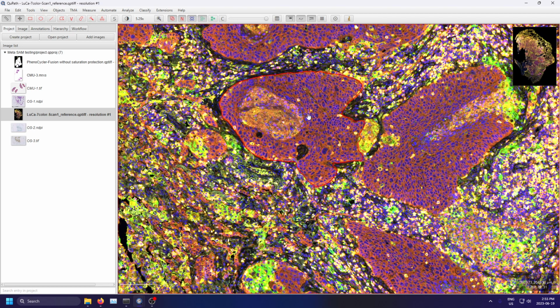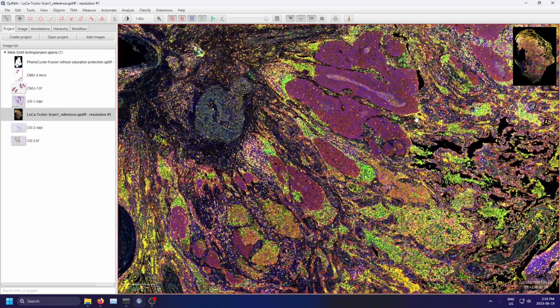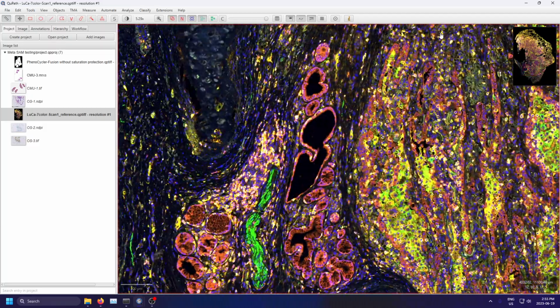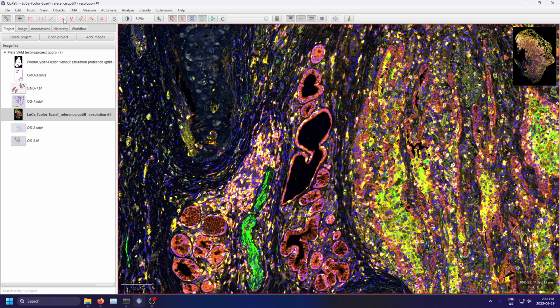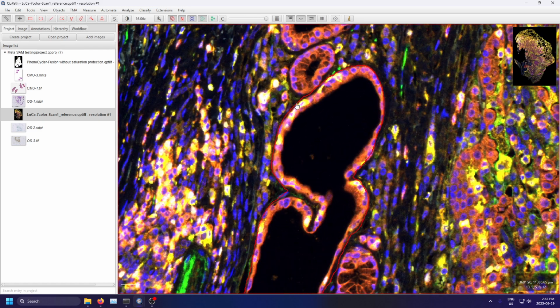Again, it really depends on the channels that are being turned on, but wow, that's surprisingly accurate. Any other histological structures that might be of interest? The lumen of whatever this might be. See if we can segment this. Not essentially the lumen, or not really the lumen, but the lumen plus the cells that outline it.